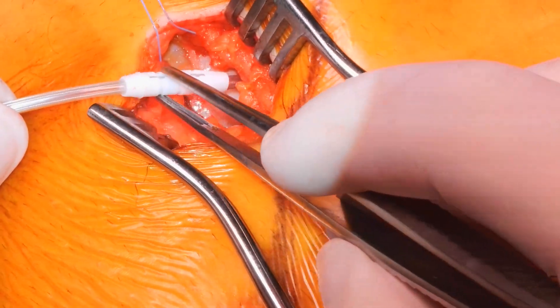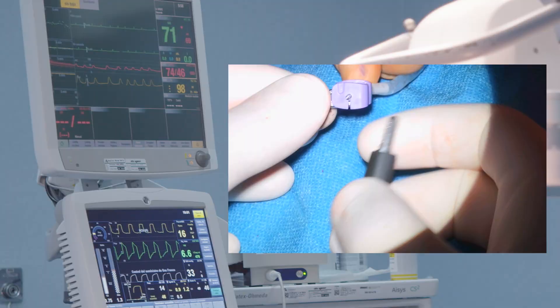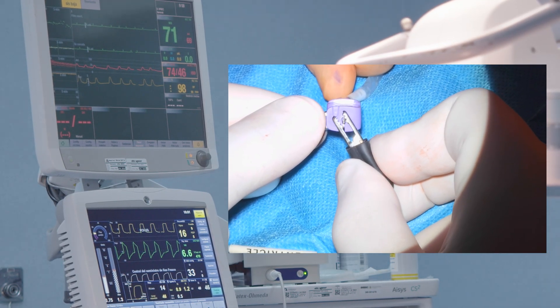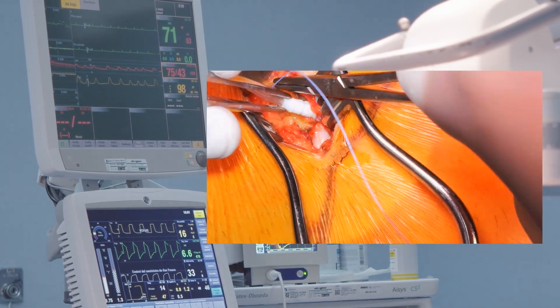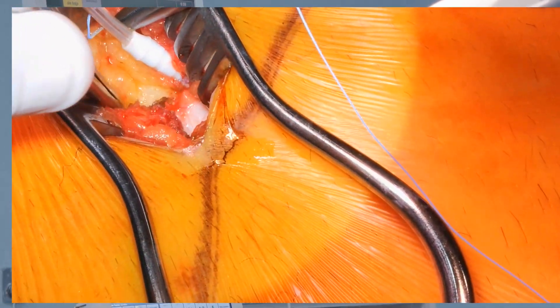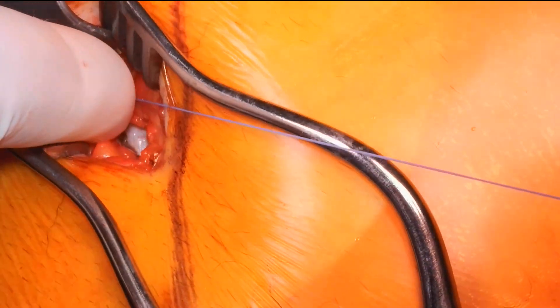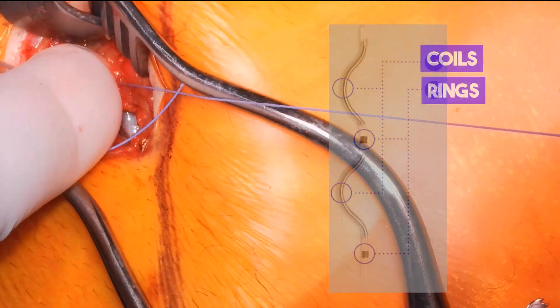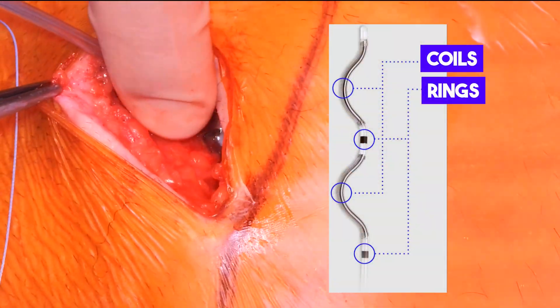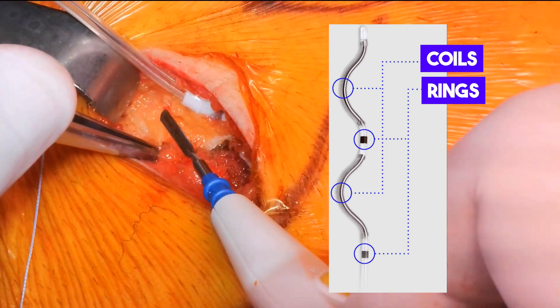We hold the lead and carefully remove the tunneling tool. The lead is then secured with a non-absorbable stitch. After confirming adequate sensing and stimulation of the lead, two additional stitches are placed to hold it in position. The lead senses the heartbeat and delivers appropriate therapy through its four electrodes — two coils and two rings — supporting three different pacing vector options and three sensing vector options.